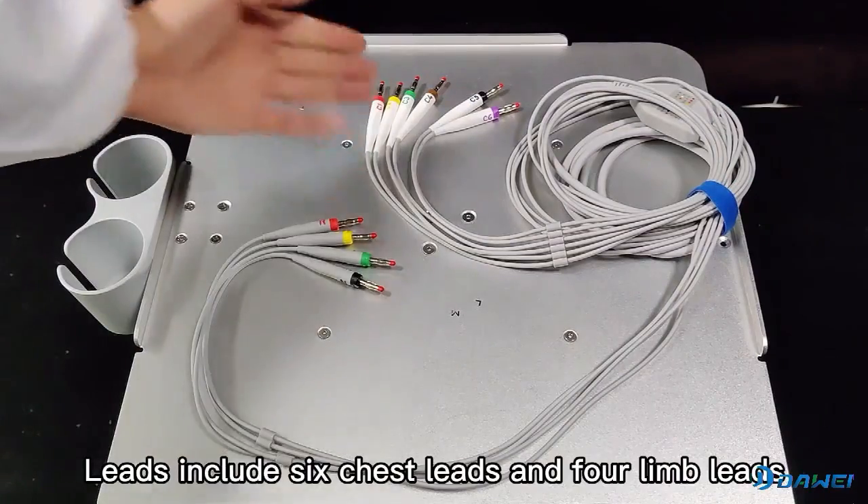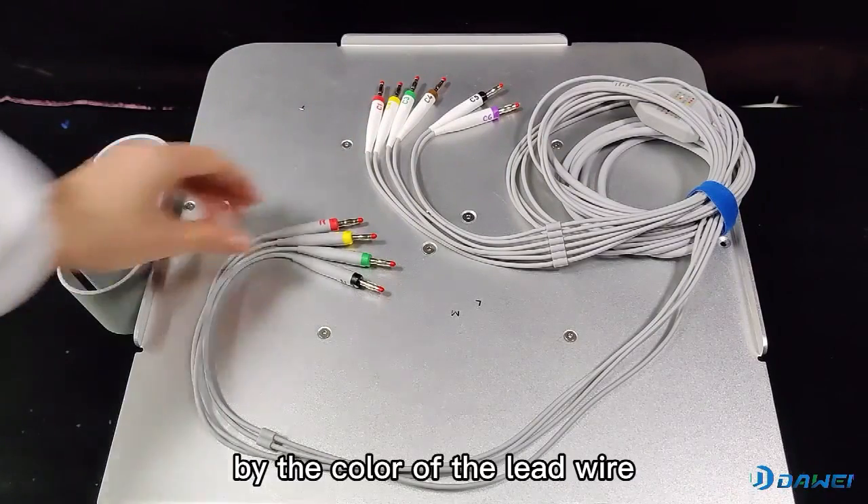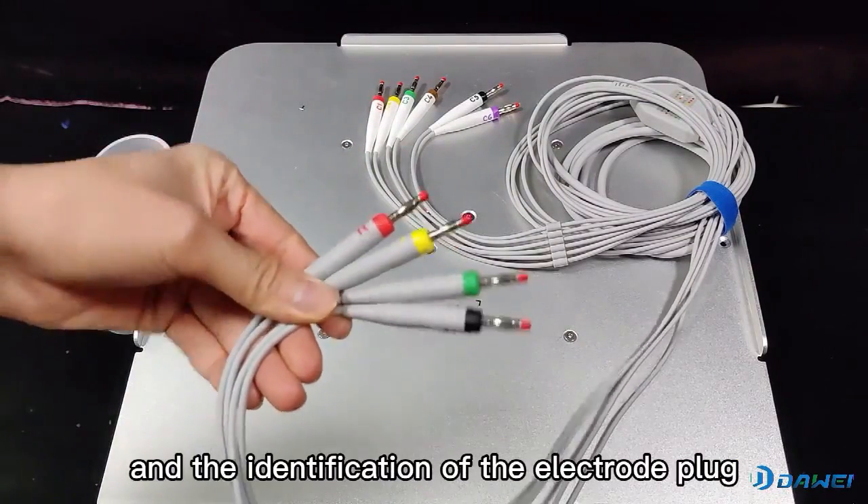Leads include 6 chest leads and 4 limb leads. Users can distinguish chest leads and limb leads by the color of the lead wire and the identification of the electrode plug.